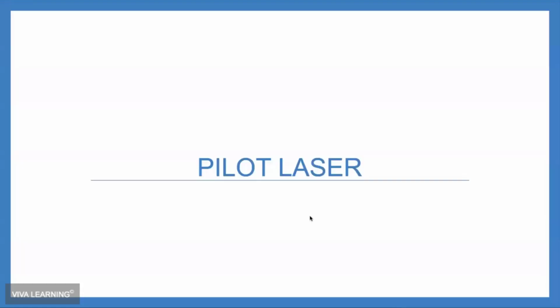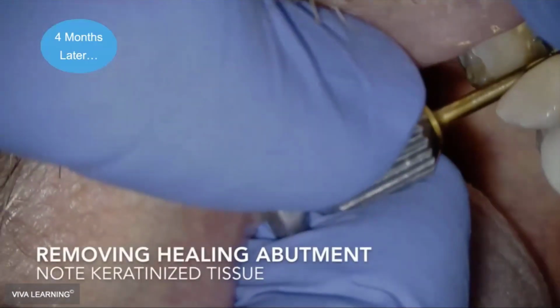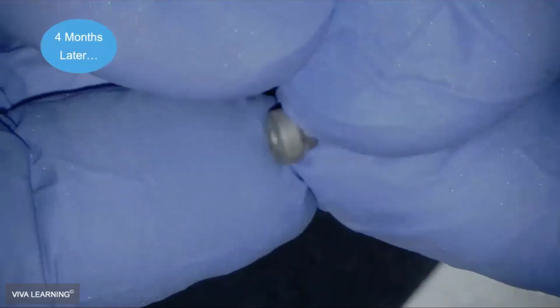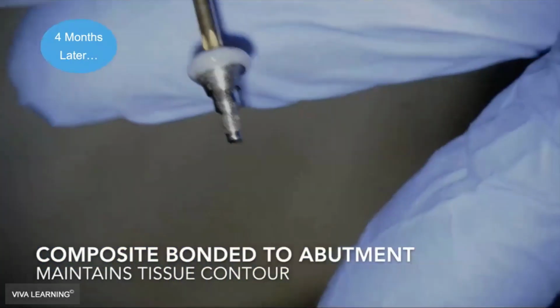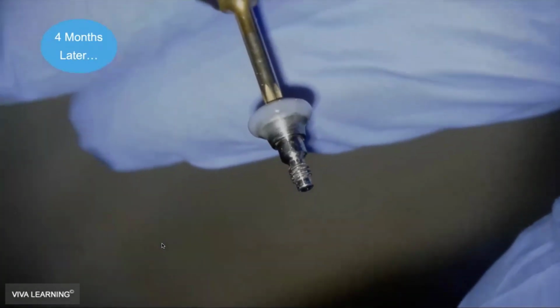Actually, I'll go back because that's an interesting thing. If you're going to place this crown on a different day, which we are in this situation, you take your stock healer and you add a little bit of composite, about 1 millimeter around the whole thing. And then you screw that in to maintain those contours you just spent so much time creating.